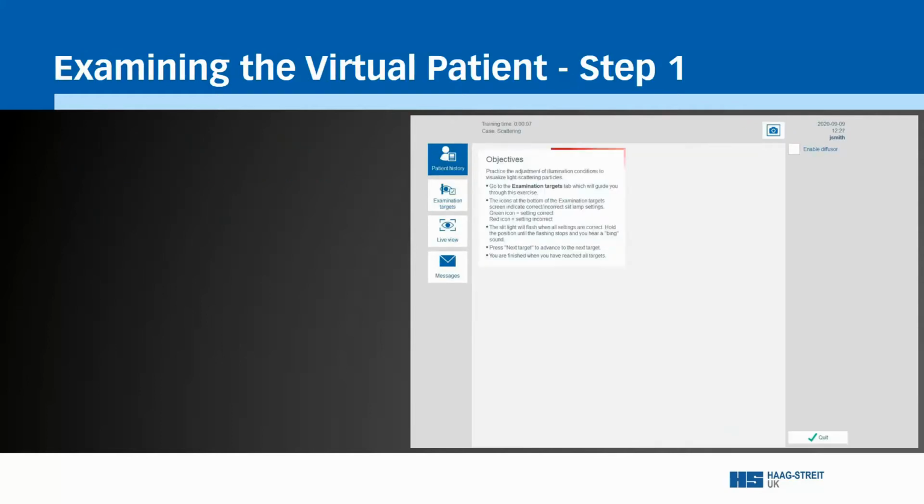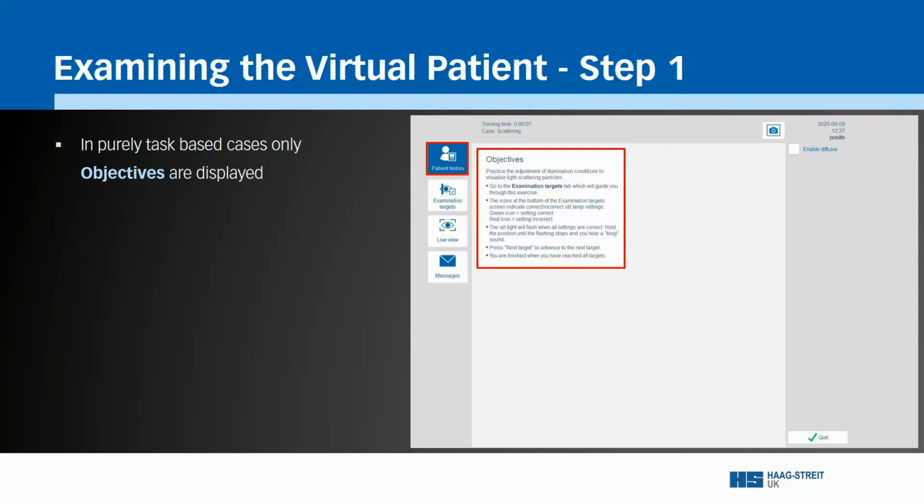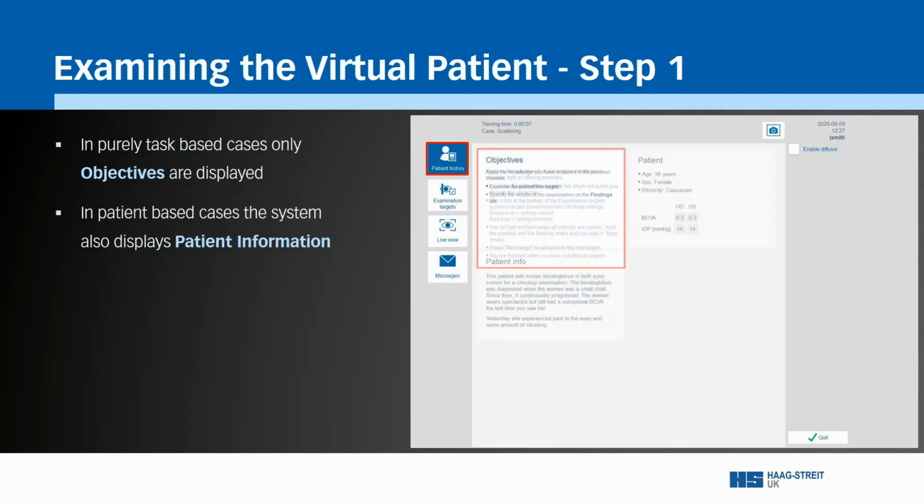The first step is to establish the objectives of any given task. You should be in the Patient History tab to do this. In purely task-based cases, only the objectives are displayed. But in patient-based cases, additional detailed patient information and history is also visible.